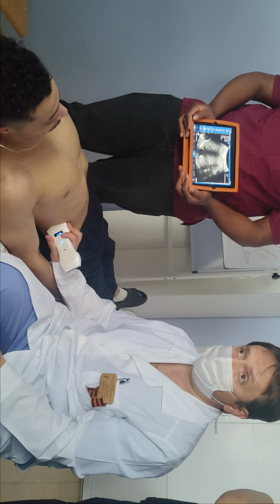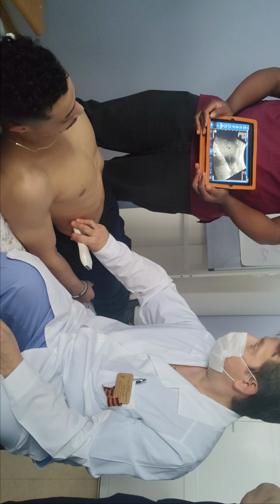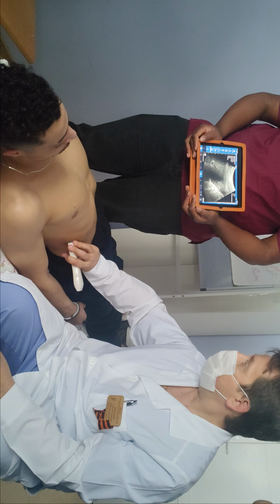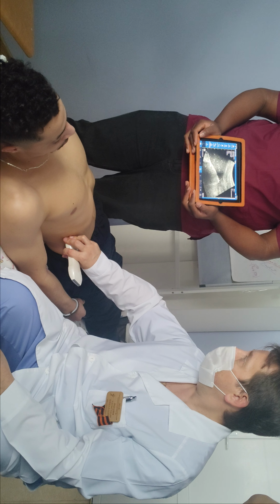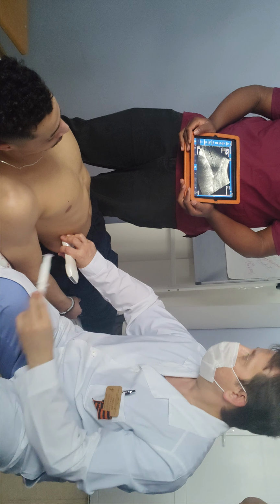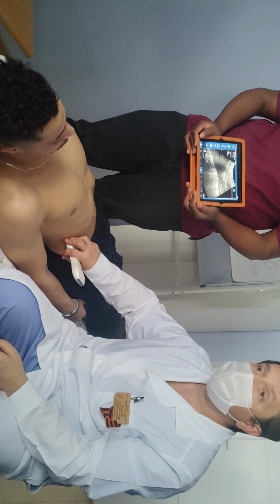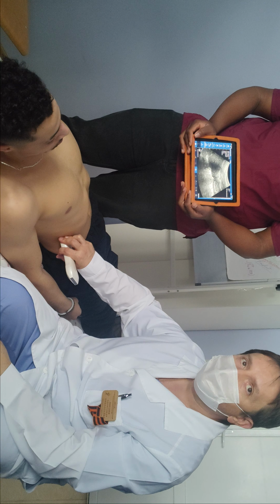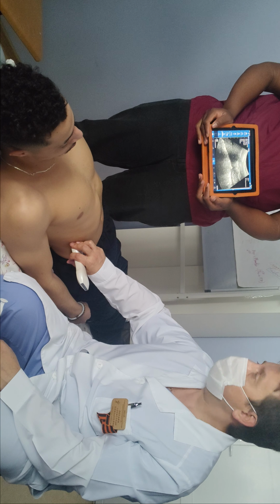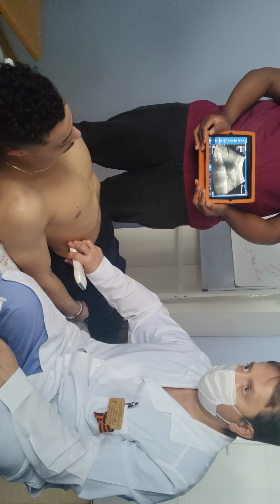Above it is what? Hepatic zone. You may in this position transfer in that direction. You see what we will see together. Again the same things. The liver is good enough, and here is the kidney. That is the kidney. Very nice. What is this? This is lung tissue. All three organs together. That is our purpose. What for? If we have damage of any organ, what will we see? We will see the distance between them. Just now we have no distance. They are glued together. It means we have no troubles.